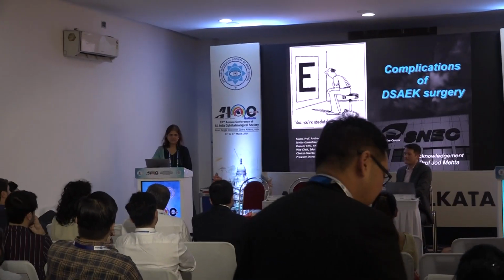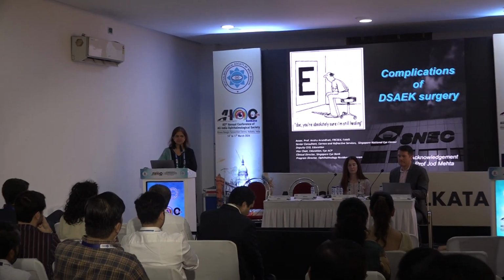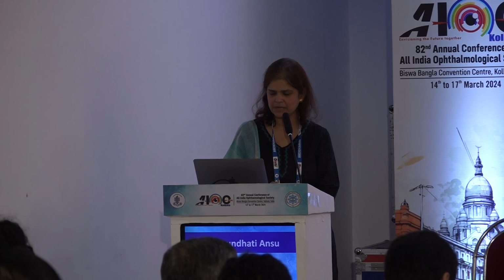Hi everyone. I've been following the talk in the morning about when to do DSAEK and when to do DMEK. I think this is nice because despite the increase in the number of DMEKs the world over, we still continue to do DSAEK for a select group of patients. Especially when you're a novice surgeon, for complex cases, it's best to stick to DSAEK, which is a lot easier to manipulate in the eye. So I'll be going through some of the complications encountered in DSAEK, which could be intraoperative or postoperative, both in the early period as well as in the late stages, and how best to manage them.